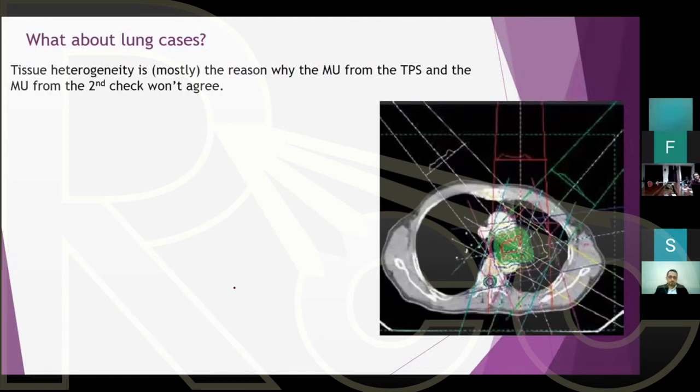Another scenario where you would have a discrepancy, maybe reaching up to 12%, is in the lung case. And the discrepancy here is not coming from air in the path of the beam. The patient's skin is more or less a straight line, and the entire beam is going inside the patient. This one, the red beam, is also seeing almost a flat surface as well. The white beam is seeing a little bit of curvature, a slight curvature. But the entire beam is incident on the skin.